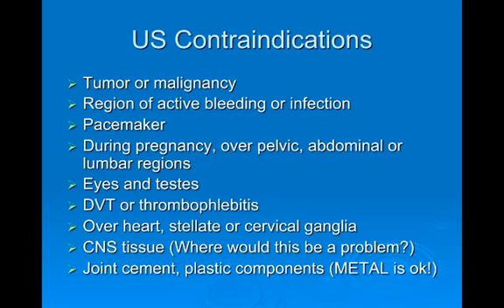All right, so looking at some contraindications, again, think about things, what don't we want to heat up? So some of these should be obvious: over tumors, active bleeding, infection, electronic device. One, we don't want to possibly heat the device up, depending on what it's made out of, but also just the possibility of affecting it. So we wouldn't want to be doing this in the region of a pacemaker. Doesn't mean we can't do this with someone who is wearing a pacemaker, though.